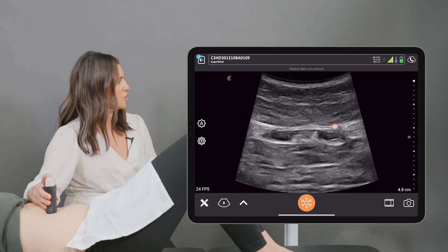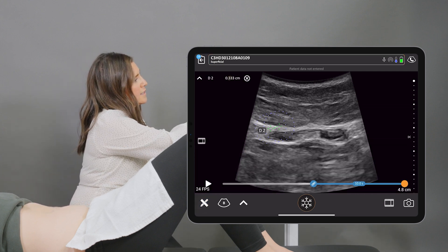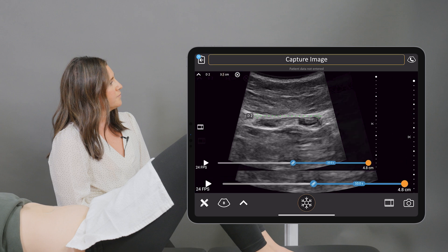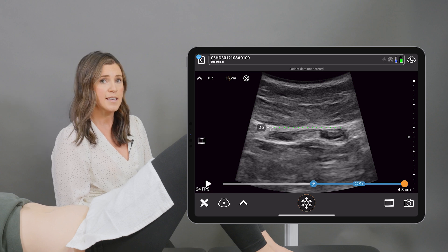I'm going to freeze the image, pull out my calipers, and measure from one side to the other. Then we're going to capture the image, and we can see that the interrecti distance is labeled at the top of the screen on the left-hand side.